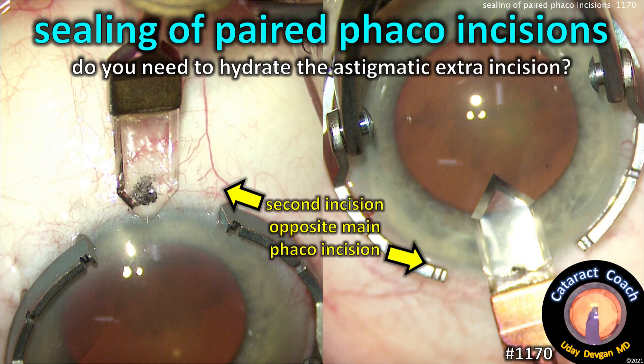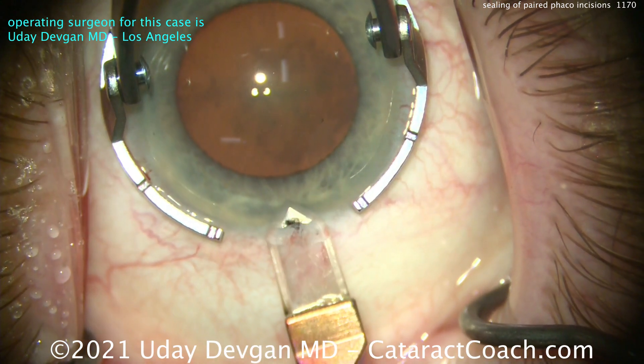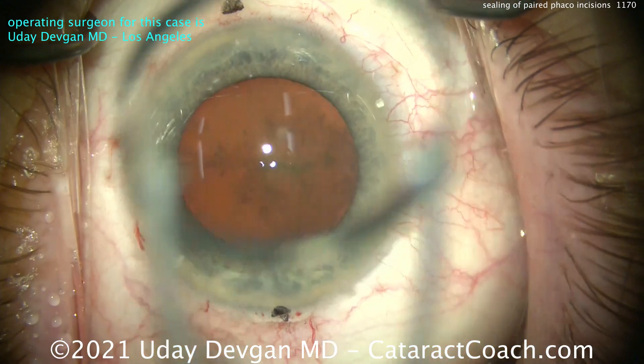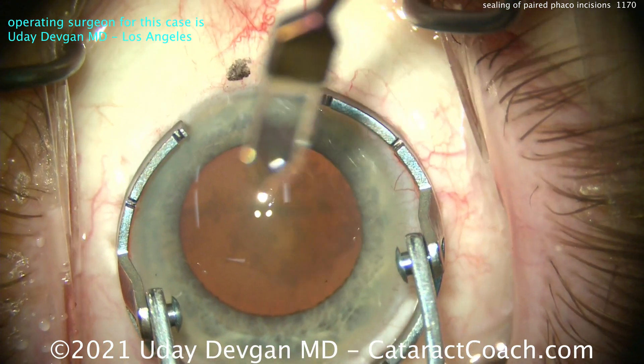CataractCoach.com — sealing of paired phaco incisions. Do you need to hydrate the astigmatic extra incision? This case shows the combined or paired phaco incision. The patient has steep astigmatism on the cornea at 180° — against the rule. There is the main phaco incision; the black marks show the exact precise meridian. And here's an additional incision.